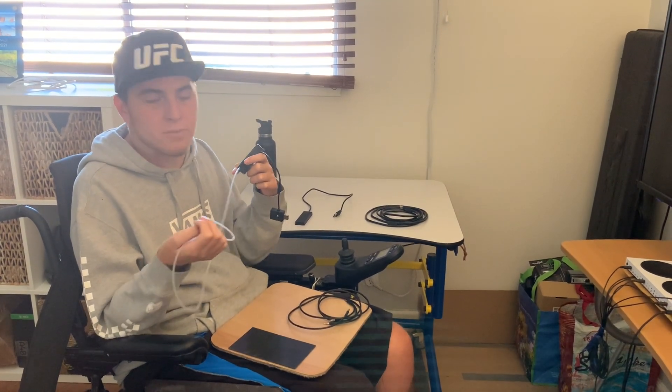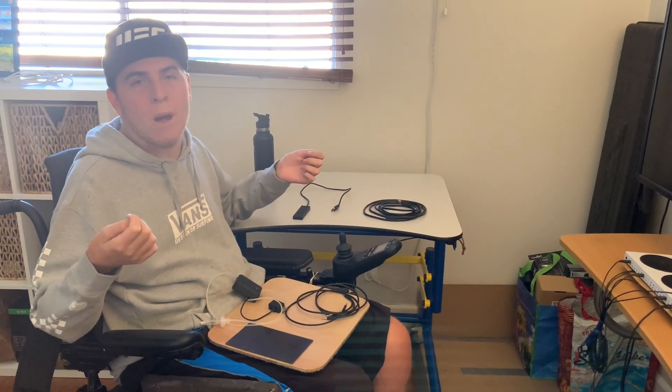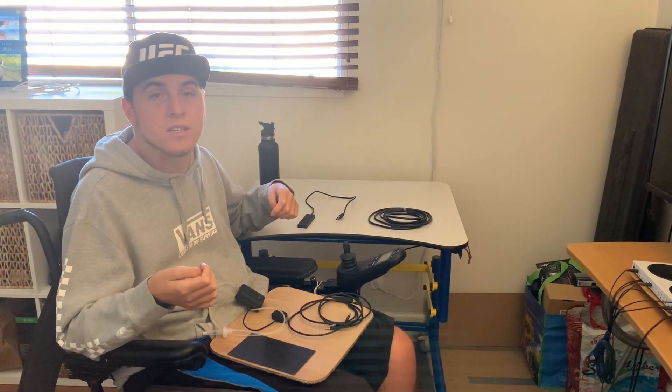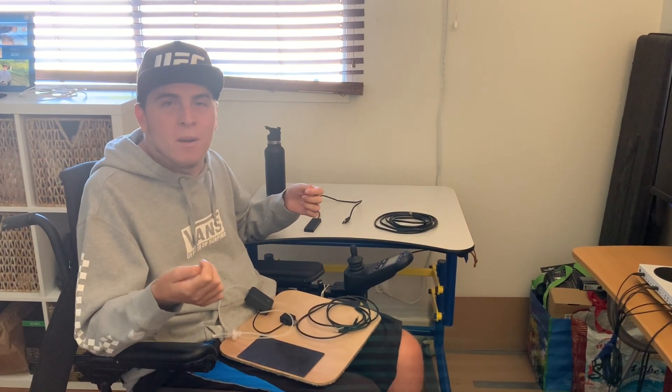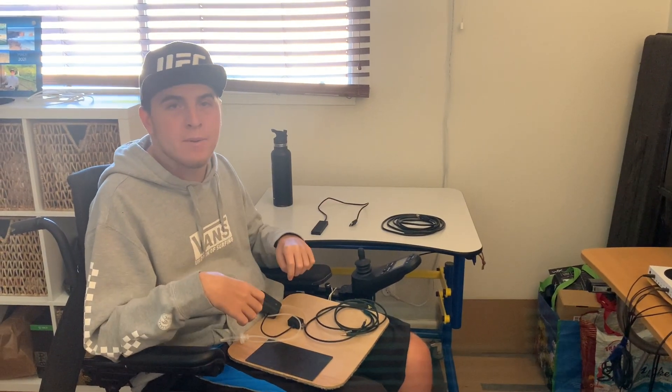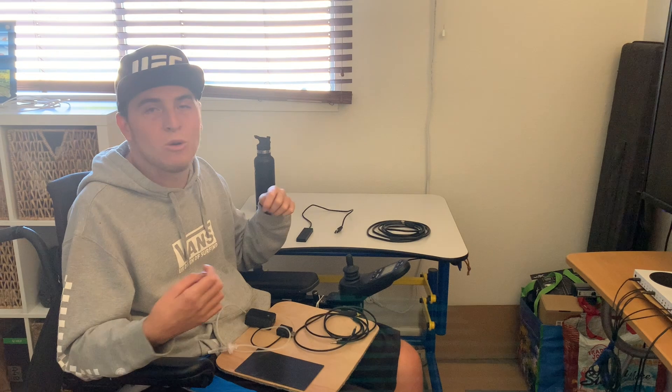Being a quadriplegic and not having hand function, one of my biggest problems getting back into gaming was figuring out how to squeeze the trigger, which you normally do with your finger. Since I don't have hand function, that makes it really difficult. Before I got the sip and puff, I had a trigger piece that I would put in my mouth and bite down on every time I wanted to shoot. I mainly play shooter games, so I needed to find a way to pull the trigger and shoot.